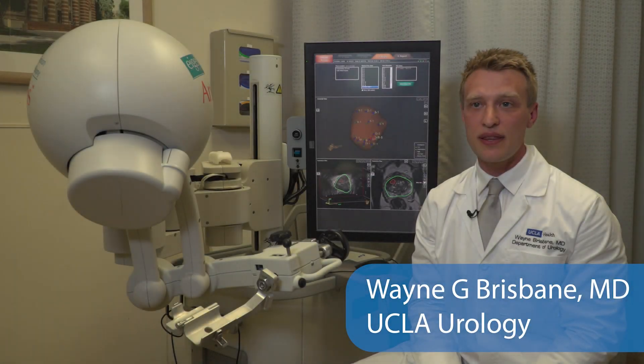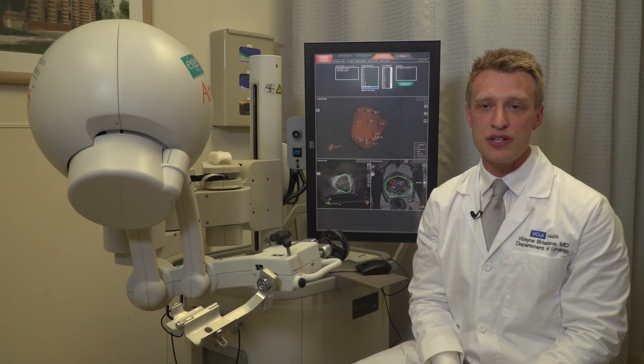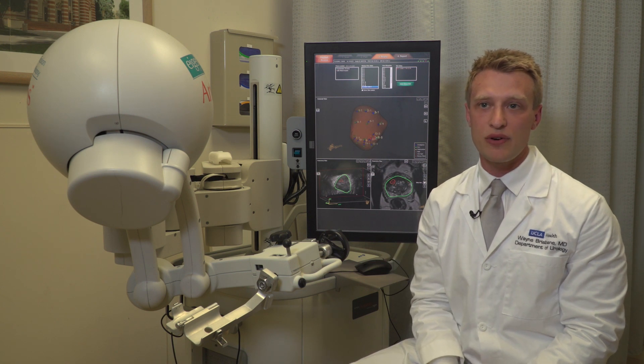In the next step, the MRI is sent to an image fusion device and the lesion is fused or incorporated into a live ultrasound image. The lesion can then be targeted for biopsy.